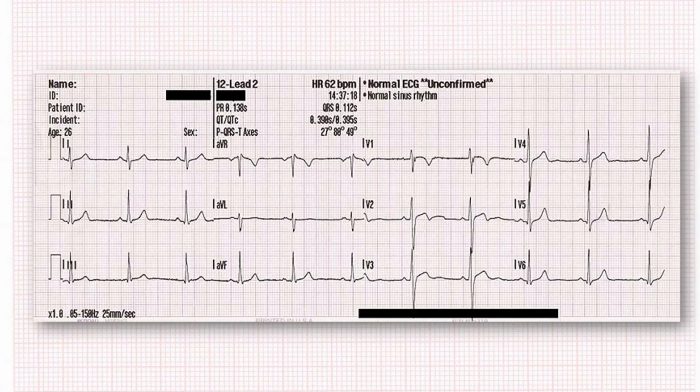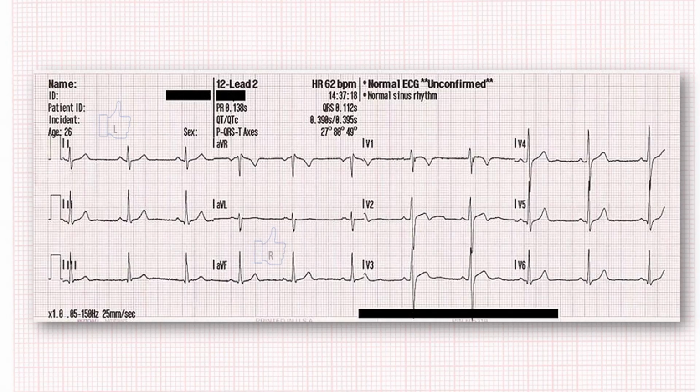So you take a normal EKG and you look in lead 1 and AVF. You imagine your left hand is lead 1 and your right hand is AVF. If both your thumbs are pointing up, then this means that the axis is normal. So thumbs up with your left hand, thumbs up with your right hand, great. Then that's normal axis. Hooray, both your thumbs are up. If one thumb is up and the other is down, the axis is deviated in the direction that thumb is up. So hypothetically, if AVF was down right now, my right thumb would go down, my left hand would still say thumbs up. So my left hand is up, which means left axis deviation.